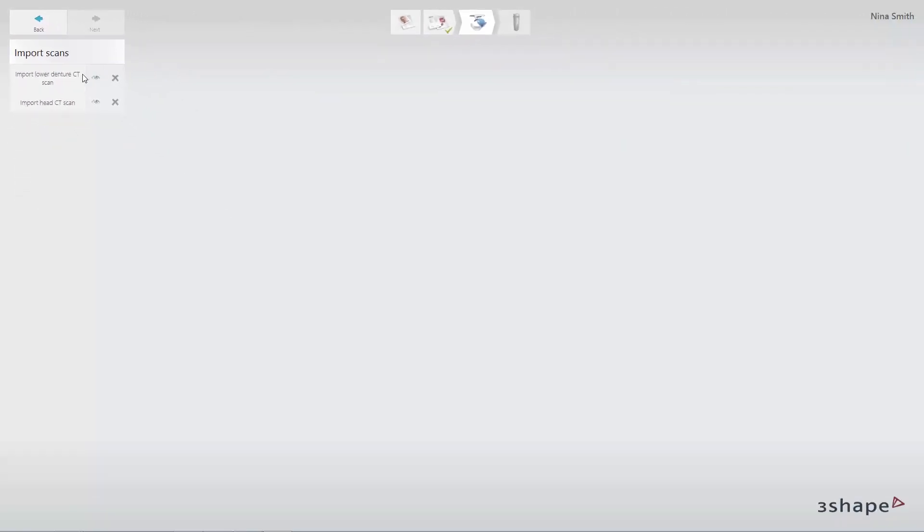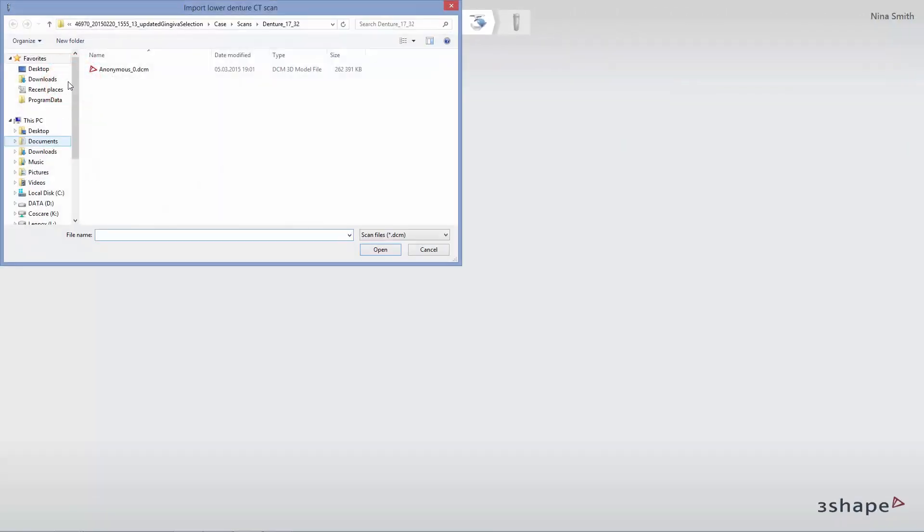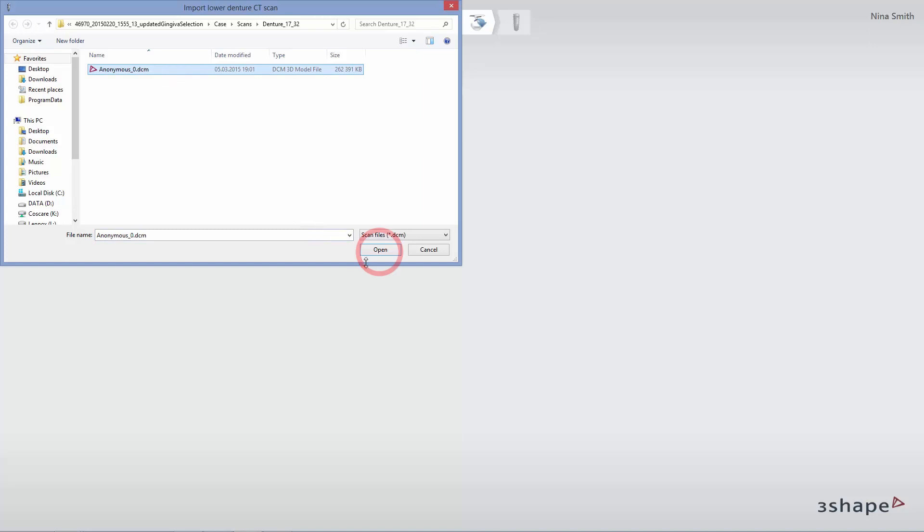Click Import Lower Denture CT Scan. Find the correct DICOM file. Open the chosen file by double-clicking it or simply click Open.